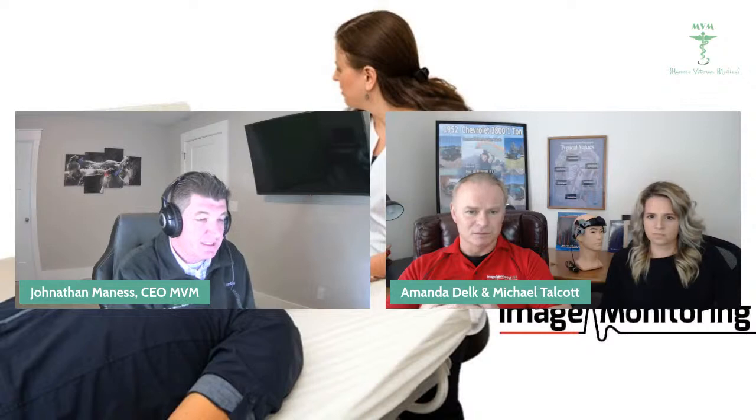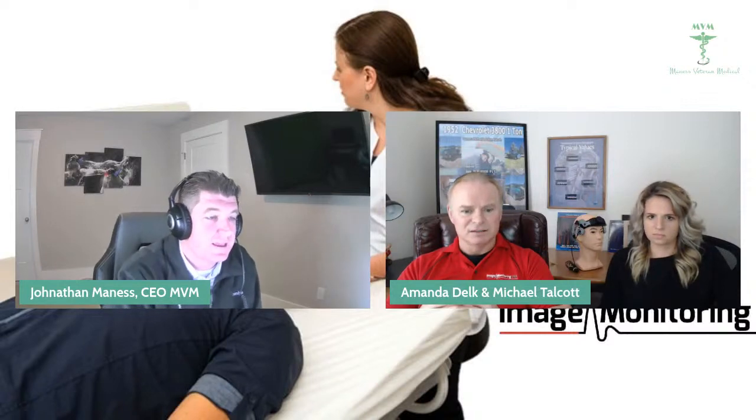So you got the system itself. What are some of the accessories that go with it? Yep. So typically you'll have the Transcranial Doppler, which is a little bit bigger probe than what a regular physiologic Doppler is. So this is a TCD Doppler.